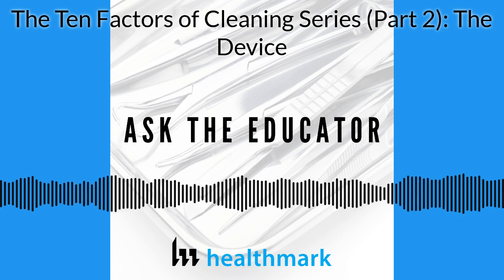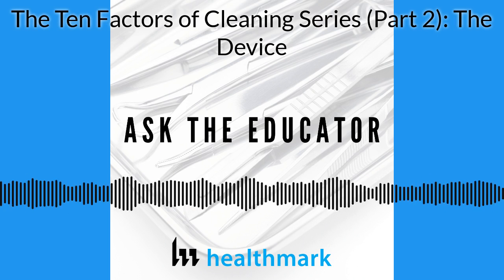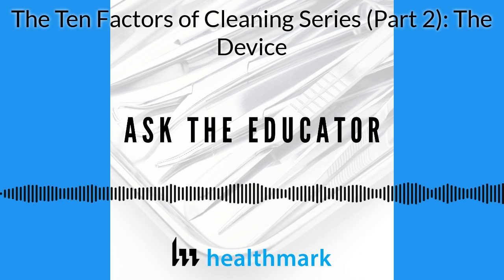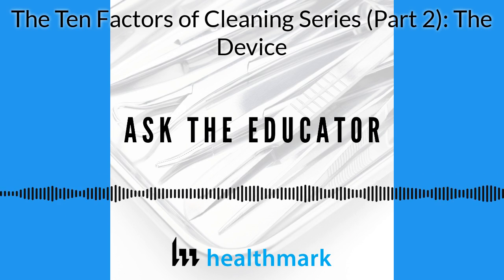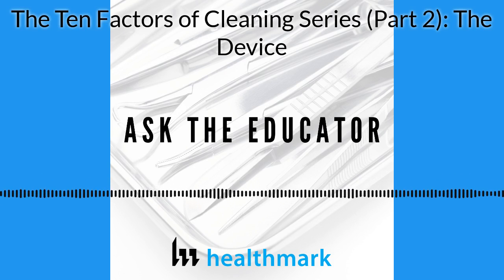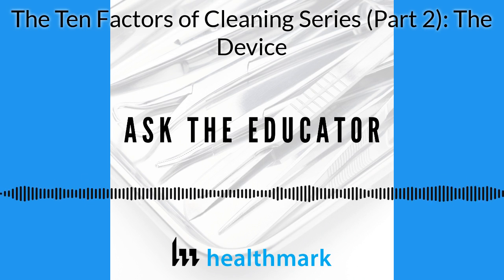But then, I mentioned this other factor of cleaning: training of your staff. They have to know how to take it apart or what to do. That training is important. If they don't have that, the device might not be clean and functional, and then they're calling Kevin, the manager or director or supervisor. "Kevin, come on down to room 9." So it's understanding how it's designed and how it's evolved.